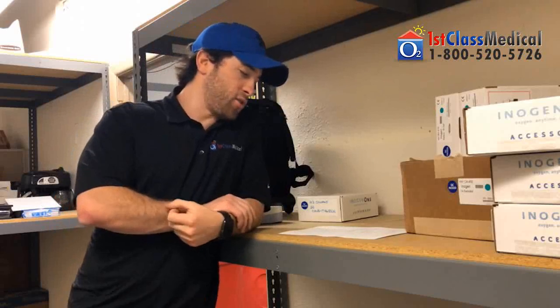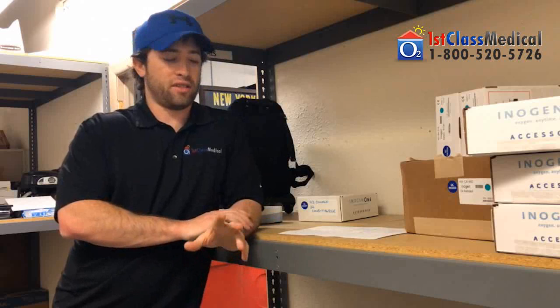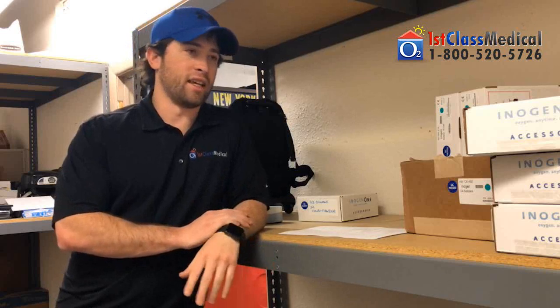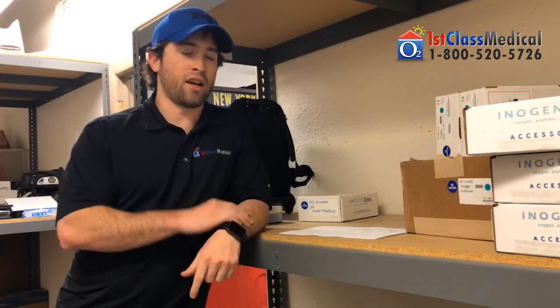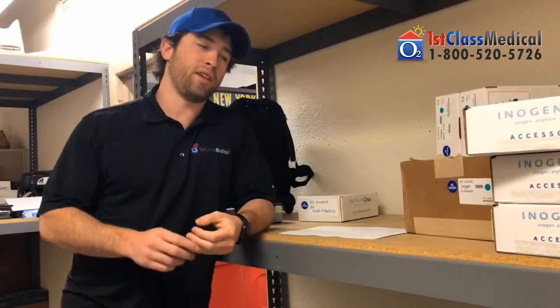A big thing I want to bring up when looking around and making your purchase is warranty. I know you see these lifetime warranties and they sound all great and dandy. Lifetime warranties will normally just cover the actual unit. It doesn't cover accessories, it doesn't cover sieve beds, it doesn't cover the actual stuff that needs maintenance. So be careful when you shop around for lifetime warranties.